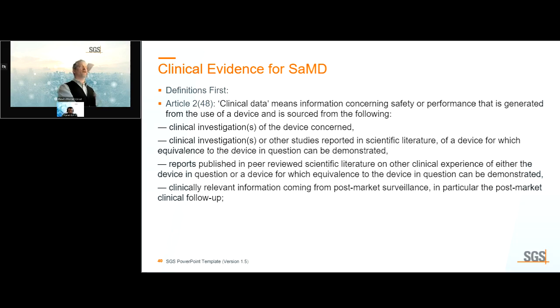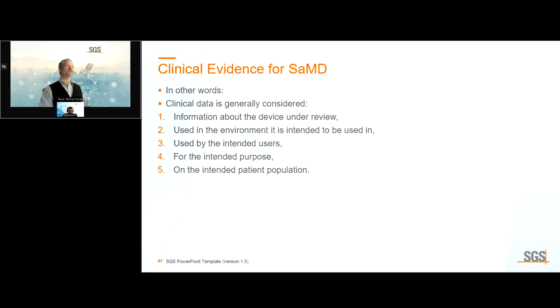I love the following definition. This is a much more straightforward way to think of it. Clinical data, if the answer to all of these is yes, then it is clinical data. It's the device under review, used in the environment intended to be used in, by its intended users, for its intended purpose, on the intended patient population. If the answer is yes to all of these, then it is clinical data.